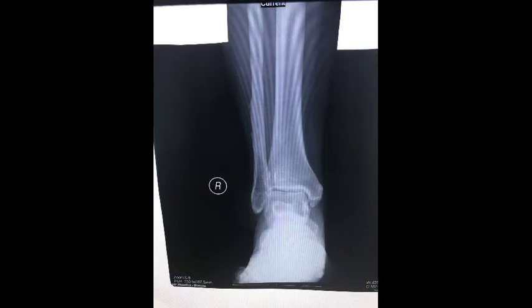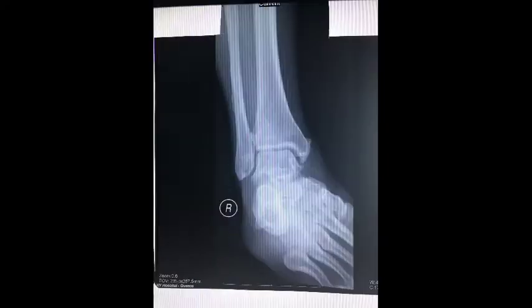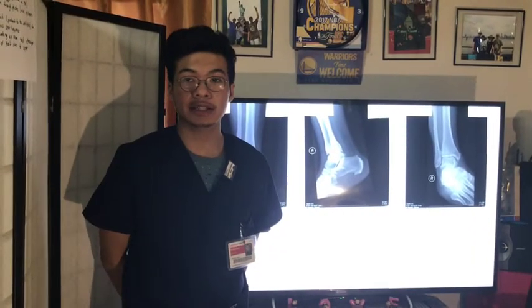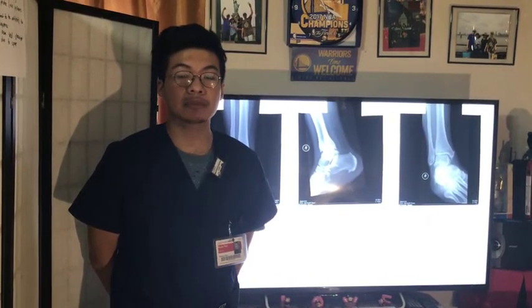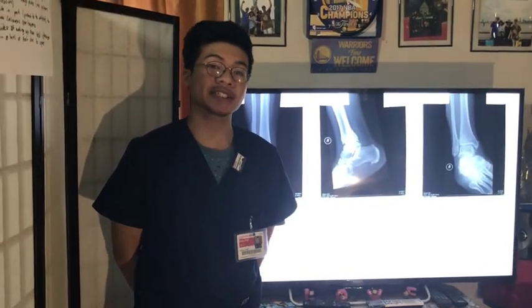The protocol of the site for the X-rays of the ankle are AP, lateral, and Mortis views. I did the lateral view first to the patient as his right foot is already positioned for the lateral. Then I asked the patient if he can move backwards for the AP and Mortis views, which he did.